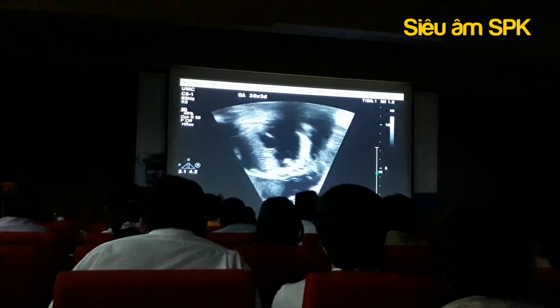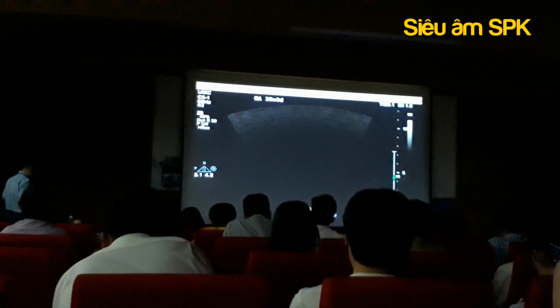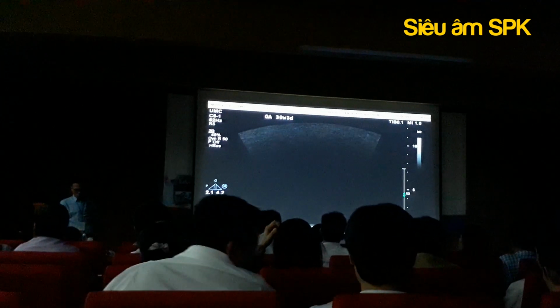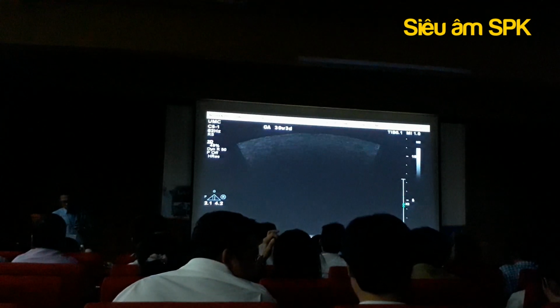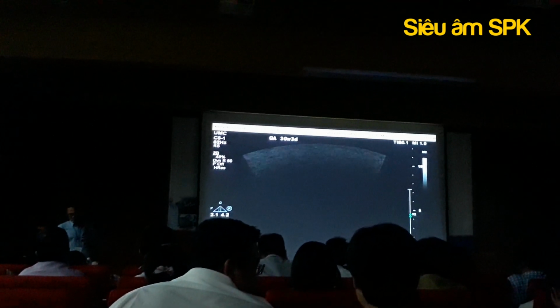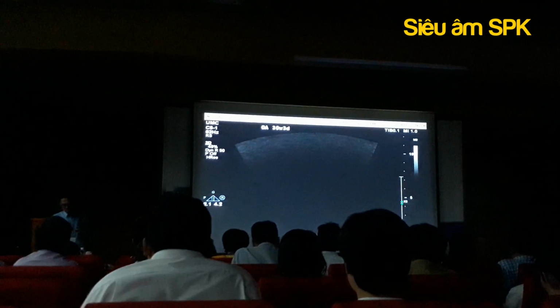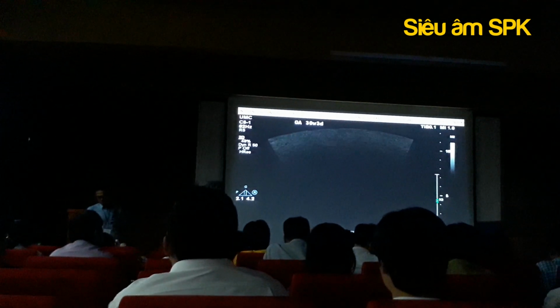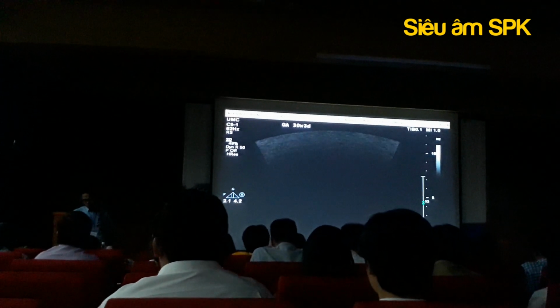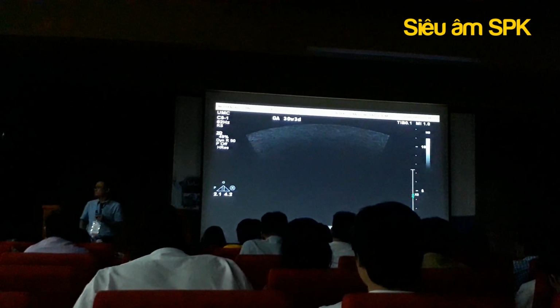So we have visceral atrial situs solitus with normal systemic and pulmonary venous connections, normal AV valves and AV relationships with a ventricular septal defect, double outlet right ventricle, subaortic VSD, pulmonary stenosis or hypoplasia, discontinuous branch pulmonary arteries with the right pulmonary artery from a right ductus arteriosus and a right aortic arch.